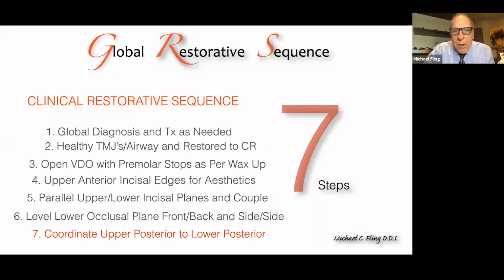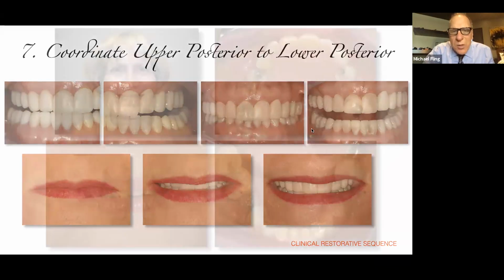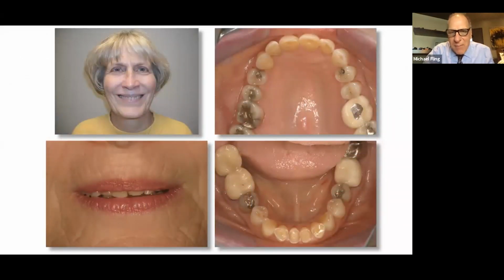Now, with the upper posteriors, I do the lower posterior first. So these are provisionalized first. And now I want to provisionalize the upper posterior to the lower posterior. This is just a really, really neat technique. So let me go through this with you just a second.